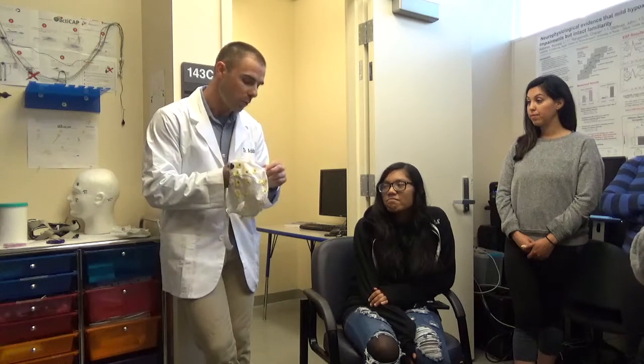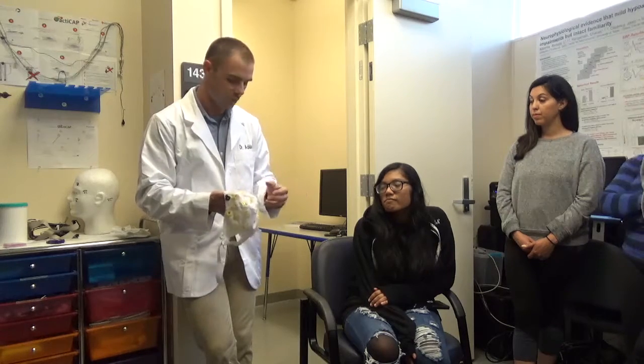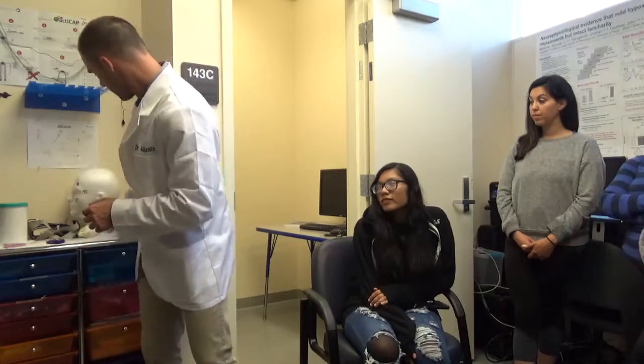One of the ways that we do that is we use some salt gel, a saline solution, and we only use the salt gel because the salt ions help to conduct that electricity, as you guys remember. It allows it to jump a little bit closer to the electrode, which makes a better signal. So we're going to fill a little bit of gel in there. You tell them it might be a little cold, a little gooey.